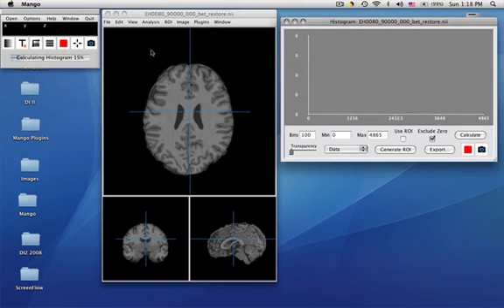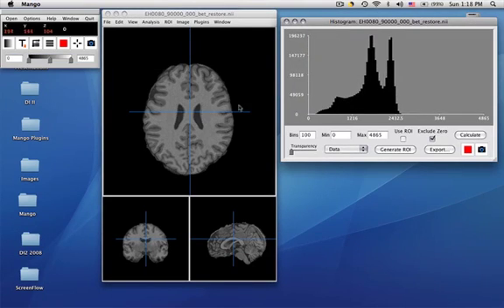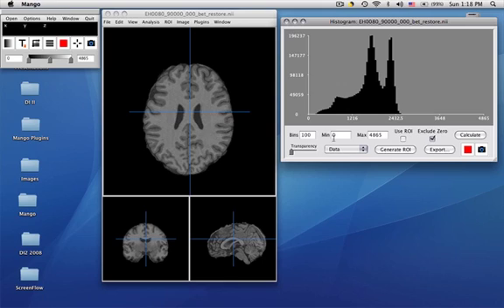So we'll pick the histogram feature, and you see the graph of the histogram being presented here. This histogram defaults to having 100 bins, and it ranges from the minimum value that we saw in the image to the maximum value, at least in the display.